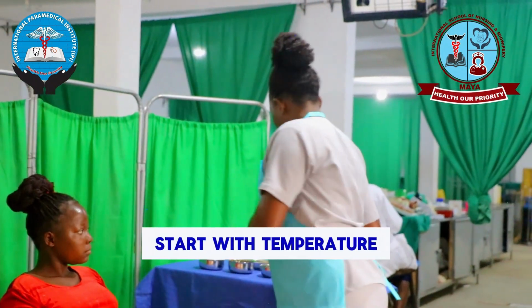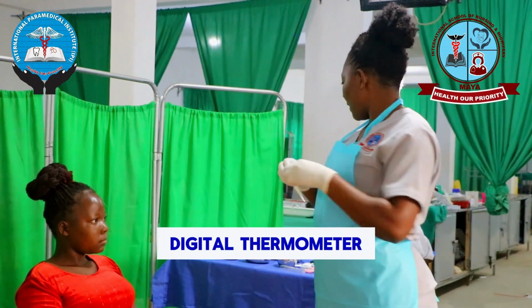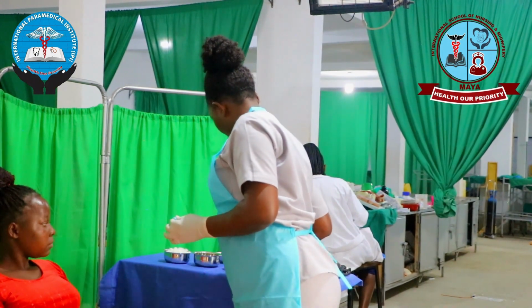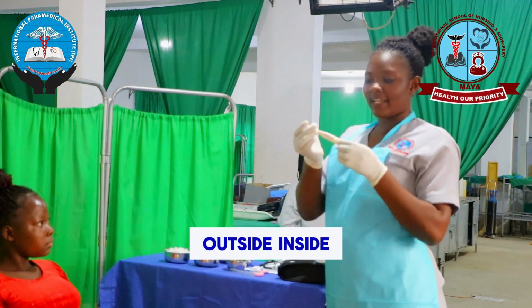So I'm going to start with temperature, and I'm using this digital thermometer. Before inserting this thermometer, I must first clean it. And when you're cleaning, you clean from outside, inside.